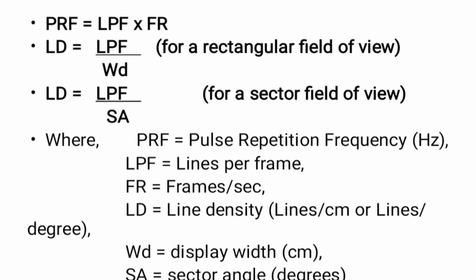So each frame of an ultrasound image is made up of individual scan lines. On the display, a single scan line in B-mode is created by a pulse from the transducer, which we've said. The transducer beam is automatically steered to a slightly different direction and fired again.